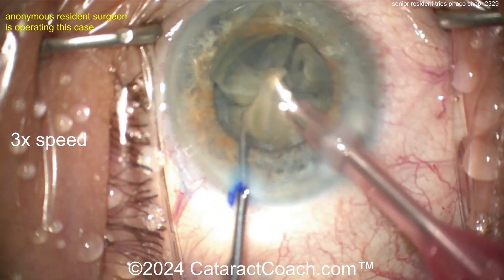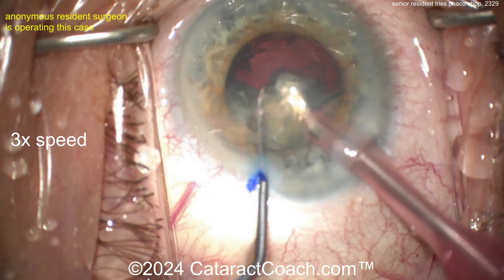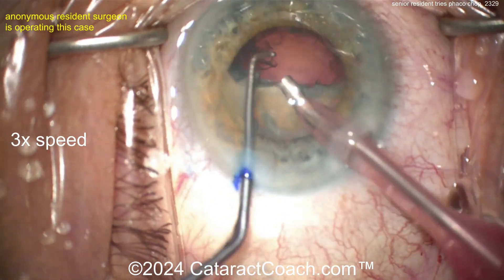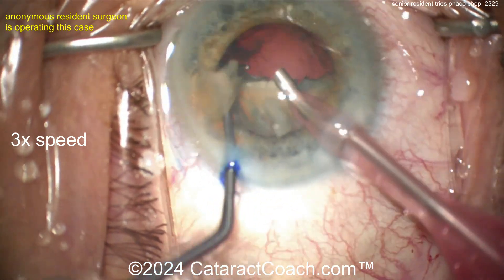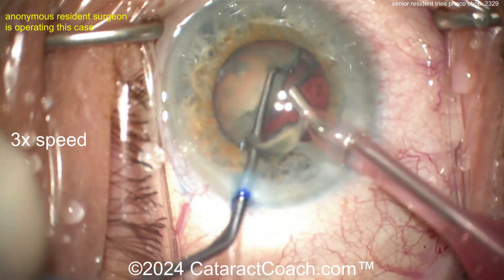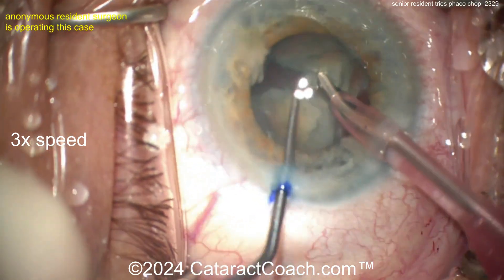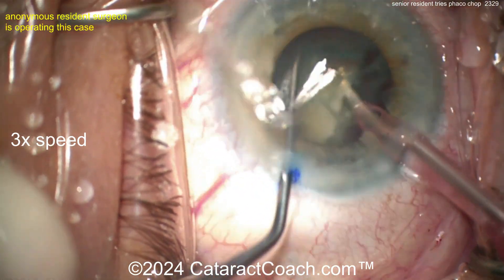Keep up the good work and remember: be your own toughest critic, don't be nice to yourself — be tough, you'll do better. Now half the nucleus is already out of the eye. Rotating it around — nice rotation. Good use of the second hand, buzzing in the middle of the nucleus to chop it again.